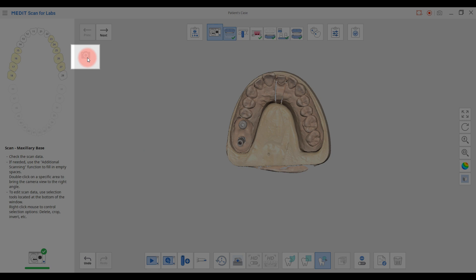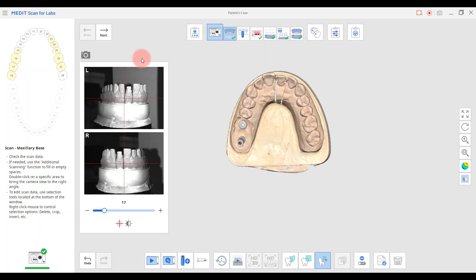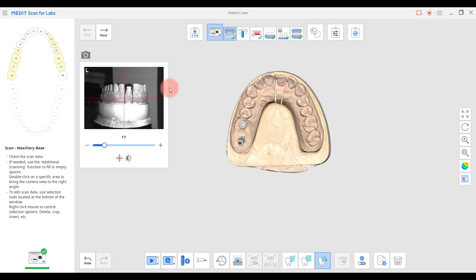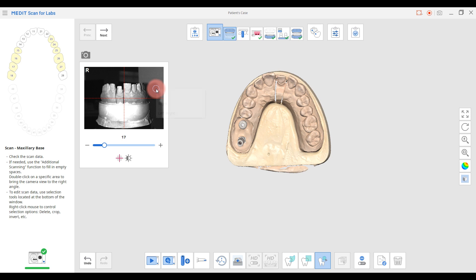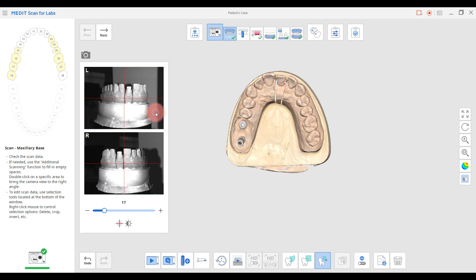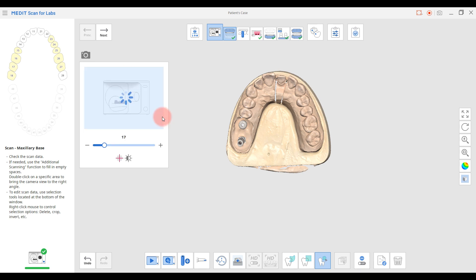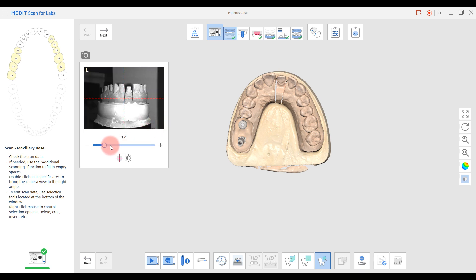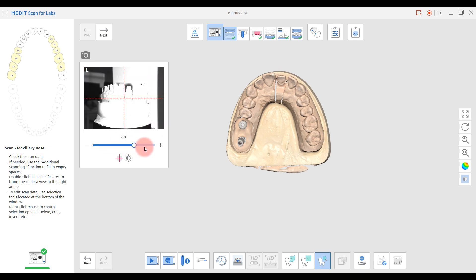If you click the camera icon, you can get the live view. Once you open the live view, you can choose the left camera, the right camera, or both cameras with a right-click. You may adjust the brightness by moving the bar or select auto brightness.